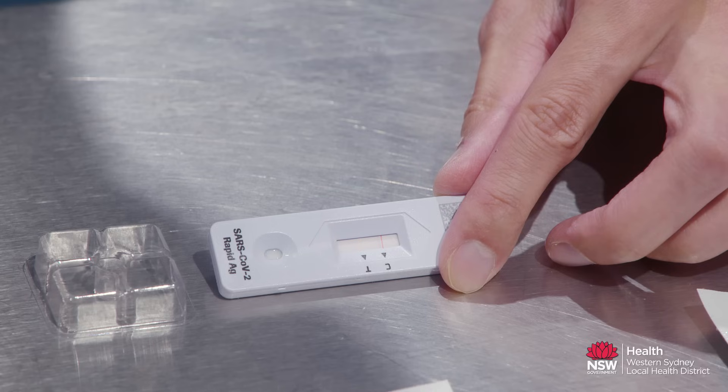If a control line is visible, regardless of how faint it is, and a test line is not visible, this means that the result is negative. If you suspect that you have an infection or your symptoms are worsening, please seek further medical attention. Take care.